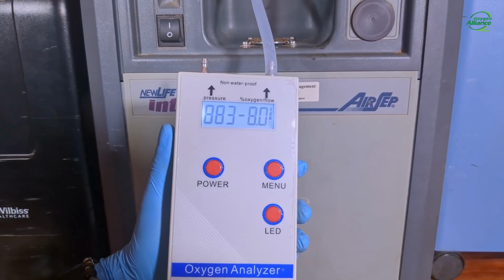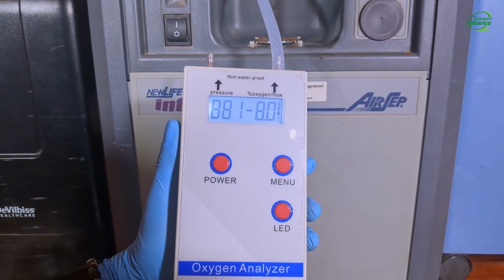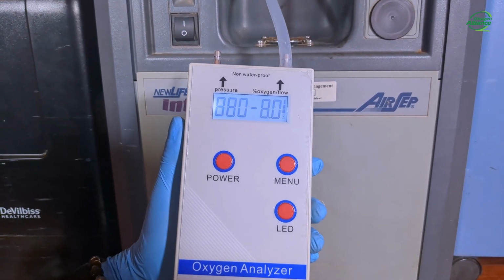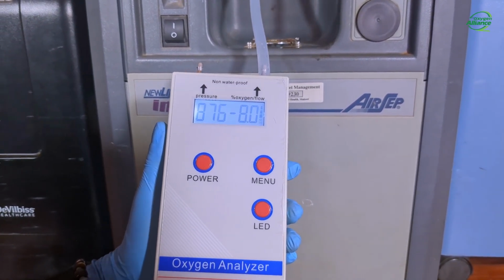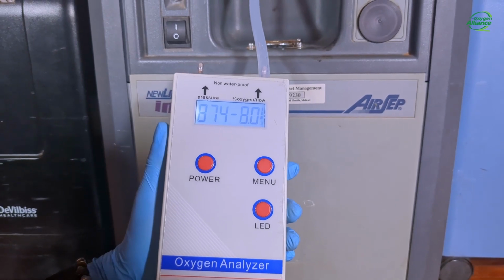So as you can see, at a flow rate of 8 liters per minute, the oxygen concentrator is able to produce oxygen at a purity of around 88%.